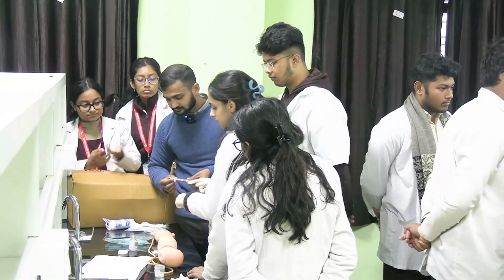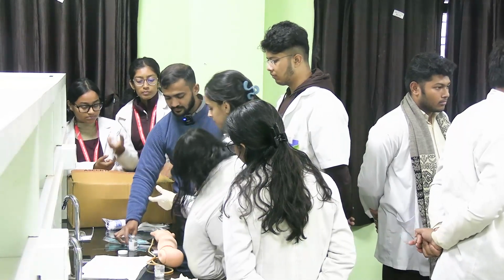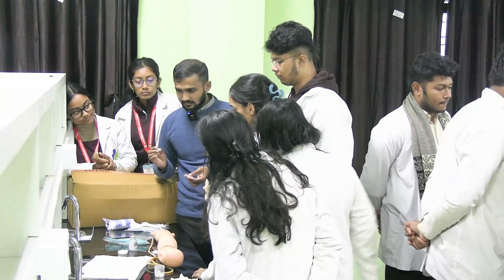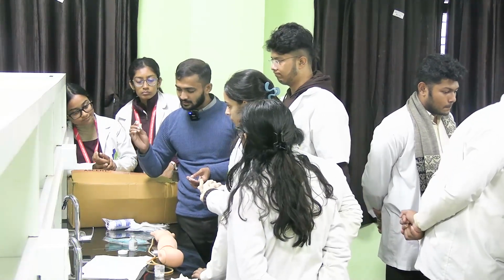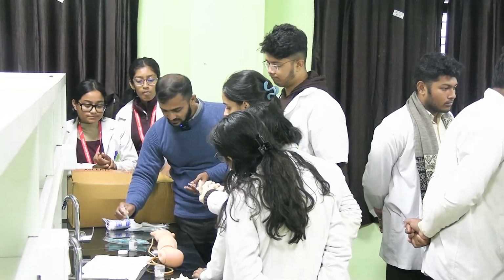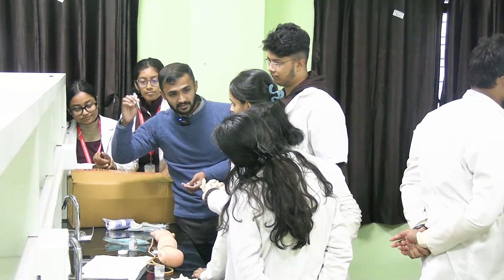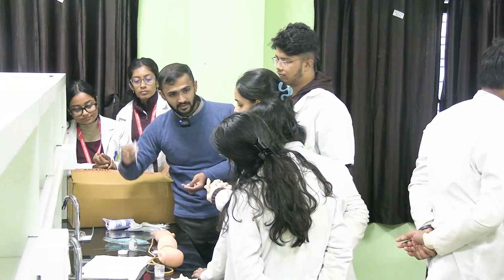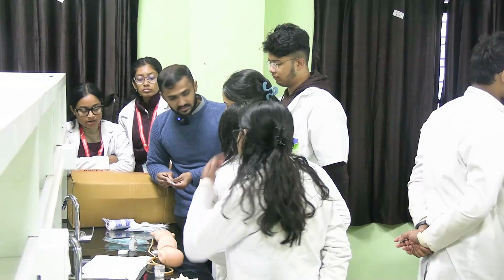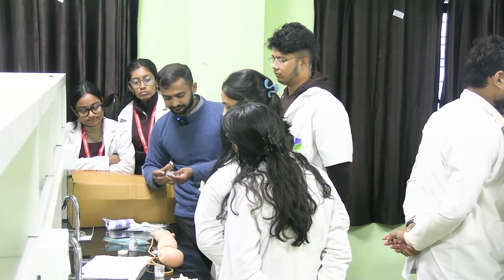By inserting the needle here, using the branch, you have to introduce the tip of the needle in such a way that the tip doesn't touch the outer portion of the ampule. It should be directly going into the ampule. It should be submerged in it, and then you'll be drawing it according to your ml, how much amount of drug you'll be taking.